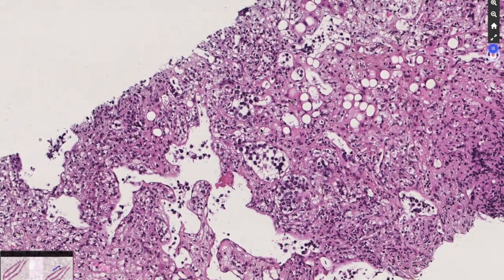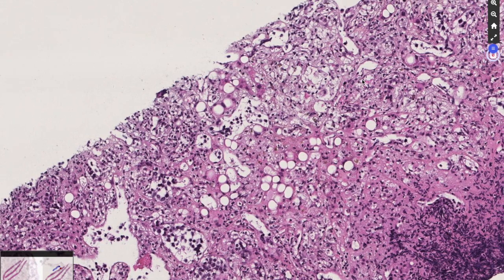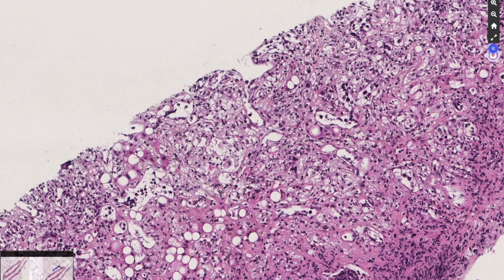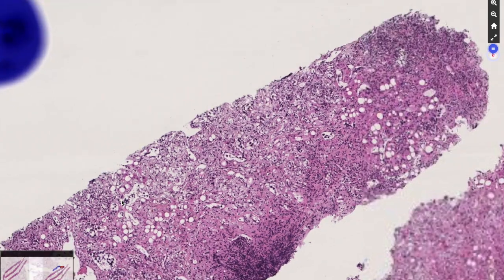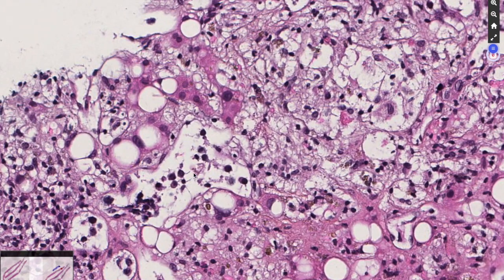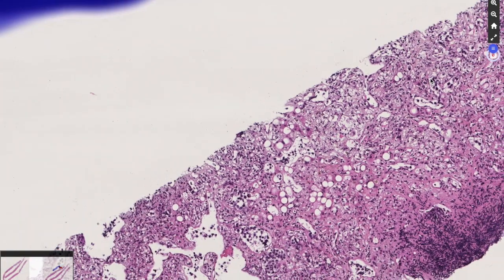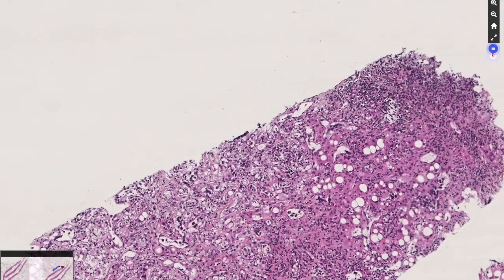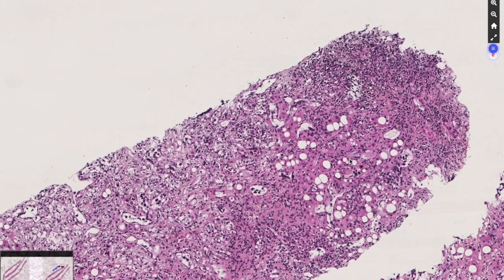When we continue to look at the biopsy, we can see a lot of these atypical cells, here, with this dark nucleus. Here again, some atypical cells with a large nucleus, large cells. And it was like this all the way. So what is important in this case is not to miss these cells. And I will now give their phenotype to you.